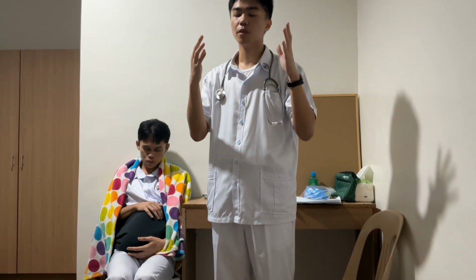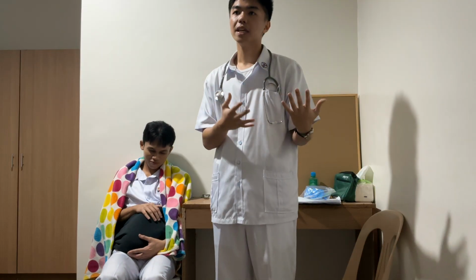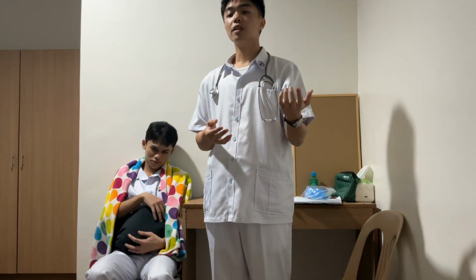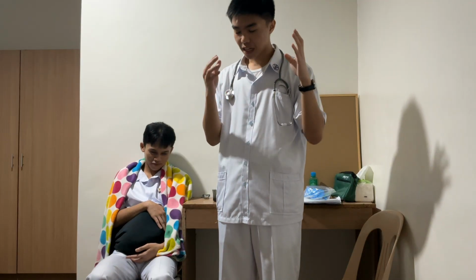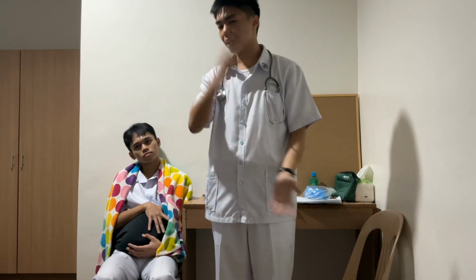So the first time, it is important to compare the blood pressure, the first take, second take, or as many takes that you took. At least 2 of them. So if there is, let's say, about 5 millimeters of mercury of difference between them, then there must be something wrong. So we take it again.